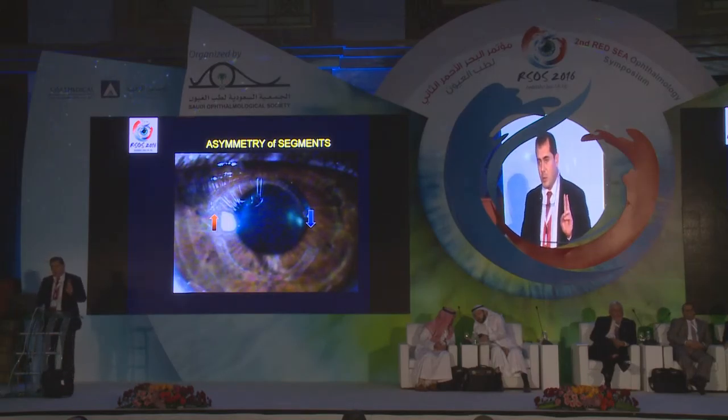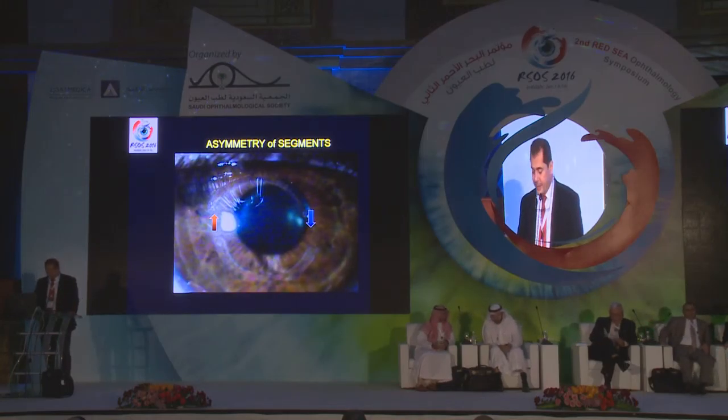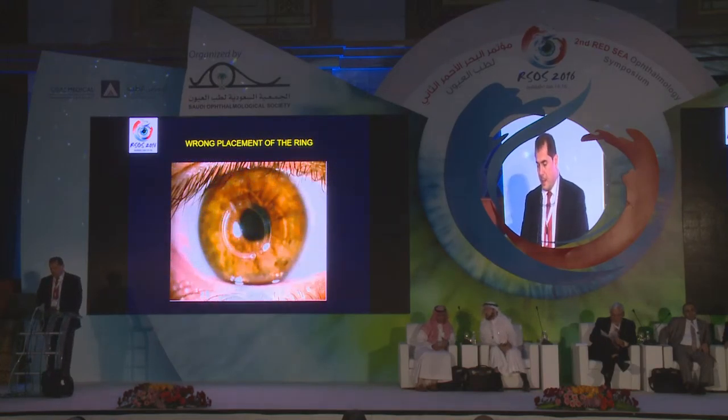It happened with me twice, but in one of them I was lucky, and I was planning to put just one segment. In the other one, I had to put two segments, so it was quite obvious that they are not symmetrical. Wrong placement of the ring.